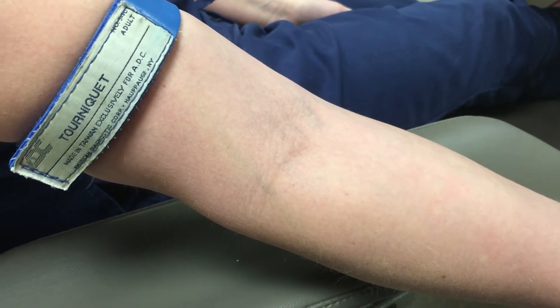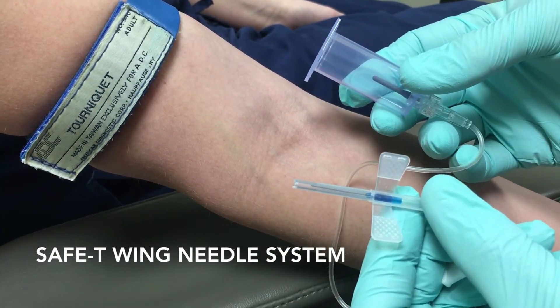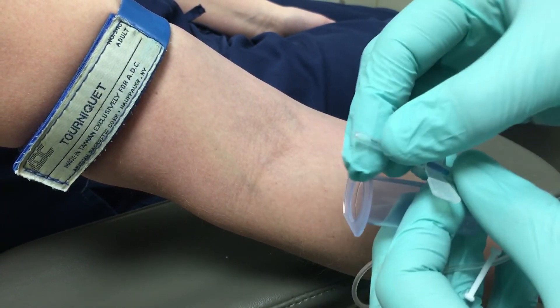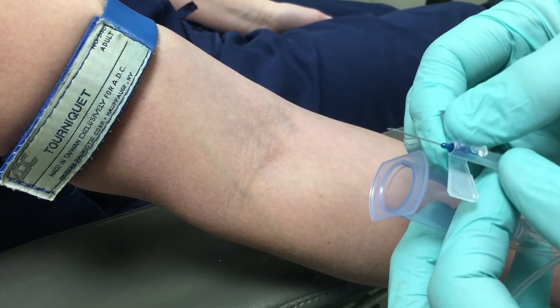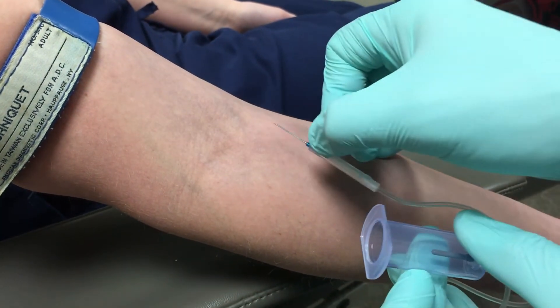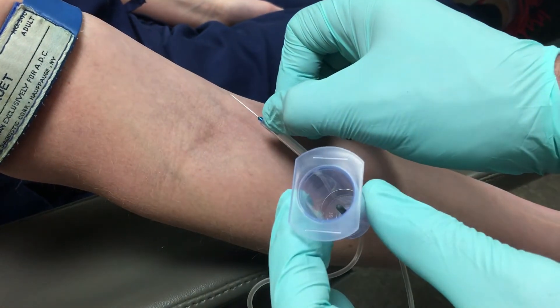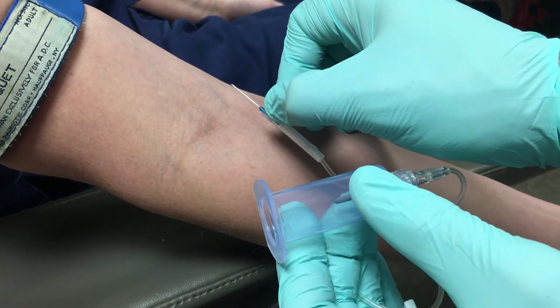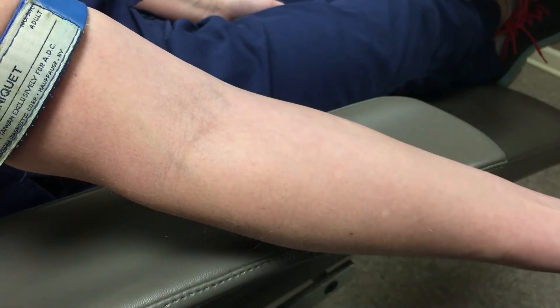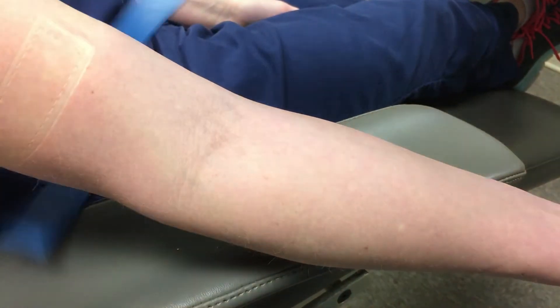The other system is the safety wing. It has a butterfly needle and the same holder, but with a pigtail. You take off the needle cap — again, you can see that it has a bevel. Use the wings of the butterfly needle. Same thing: long axis of the vein, bevel up into the vein, then place your blood collection tubes into the holder and fill those up — two, four, whatever you need to go to the centrifuge. After you're finished, place the 2x2 gauze with Dermaclear tape and then remove the tourniquet.